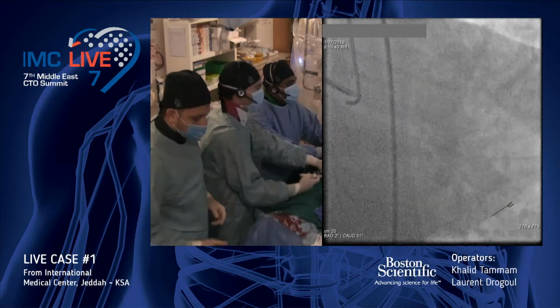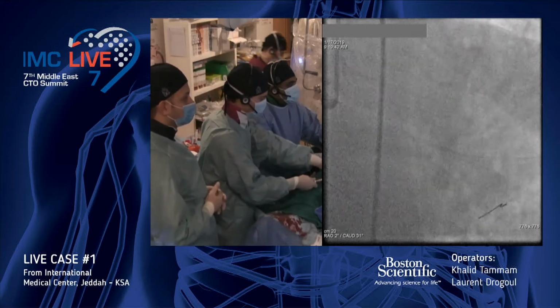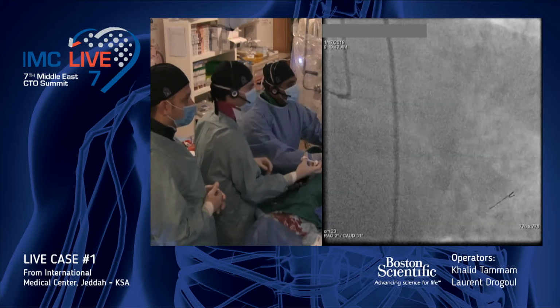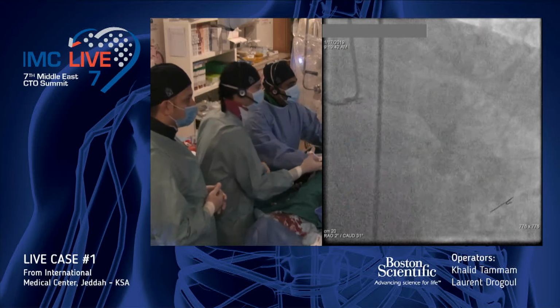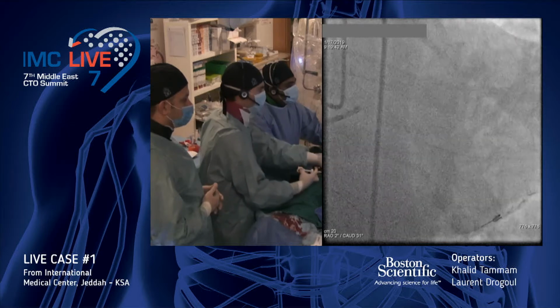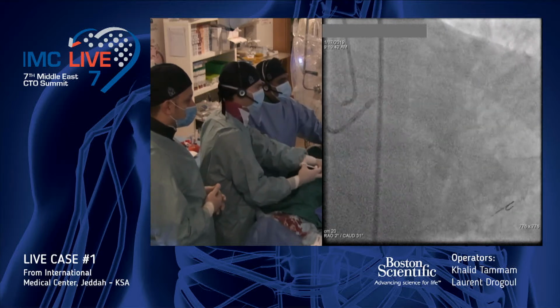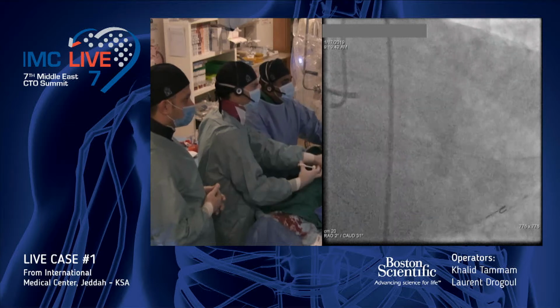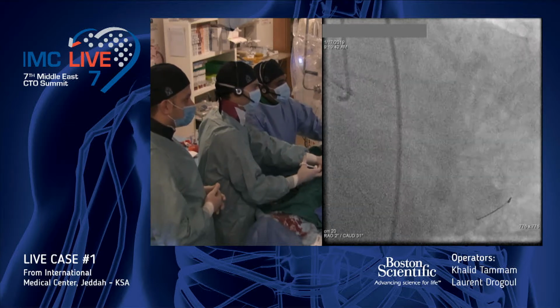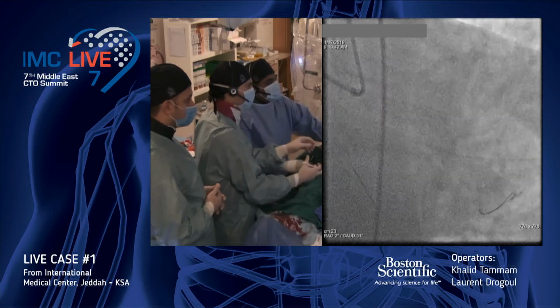Yes, it's very, very interesting. Why do I ask this question? Because if you don't know where the proximal cap is, maybe your strategy might be different. If you know how to puncture antegradely, the strategy might also be different. Nice. Do you have another idea? Yeah, I agree with Omar, but with this one I think there is a channel. So my approach will be antegrade first, then I'll try retrograde if that fails.